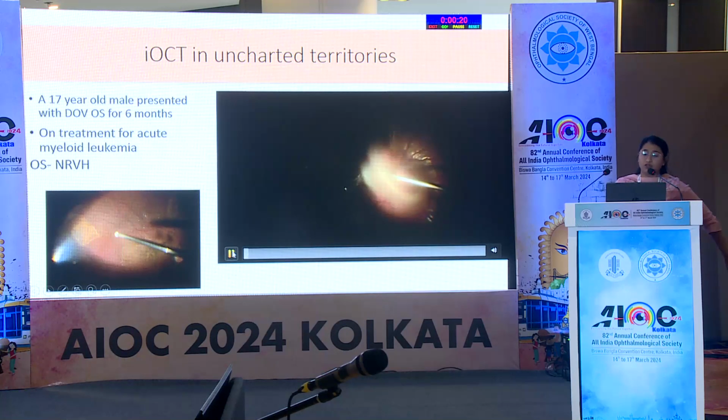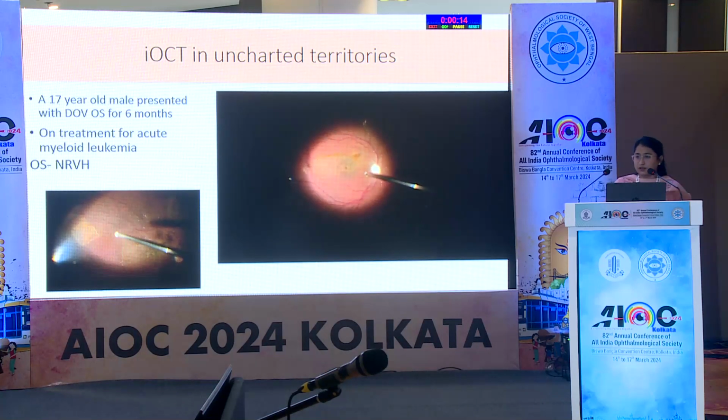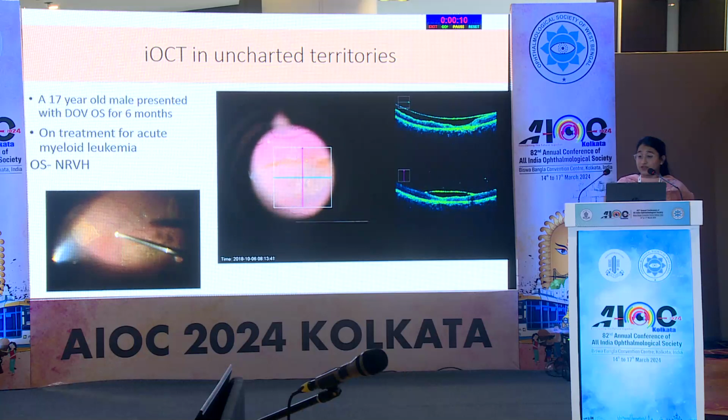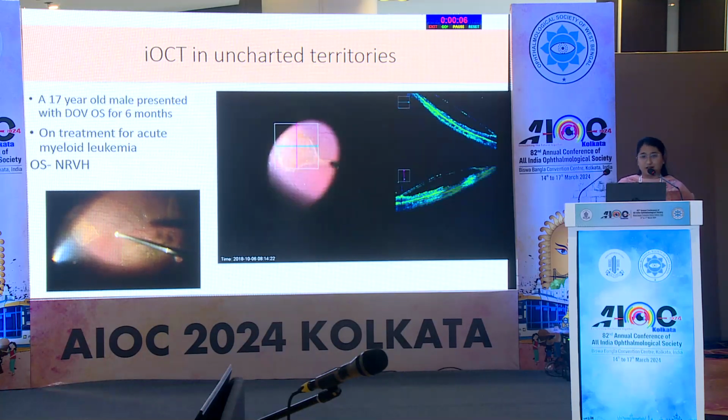So this was a patient who had leukemic retinopathy. And in this patient, we could see some pigmentary changes in the periphery. Had we not done an IOCT, we would have never figured out that these were actually areas where sub-ILM hemorrhages had occurred previously under the vitreous hemorrhage.